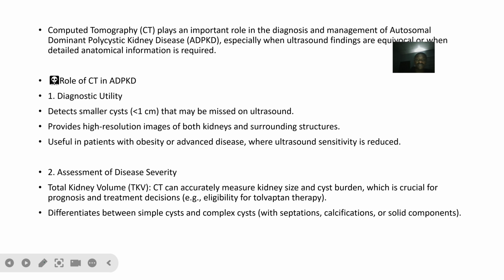You should know that it plays a very important role in diagnosing, and it helps you know what level of damage this patient is at, so that you know the type of treatment this patient will need. So, diagnostic utility.